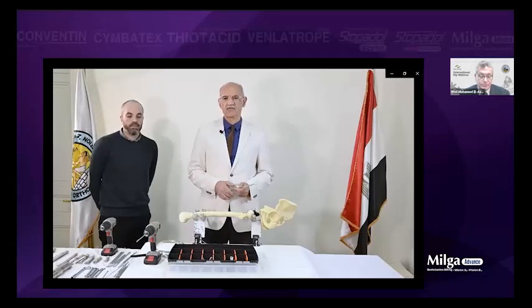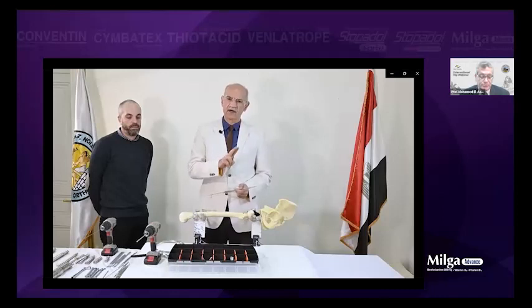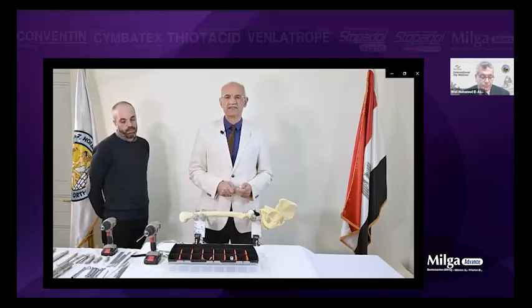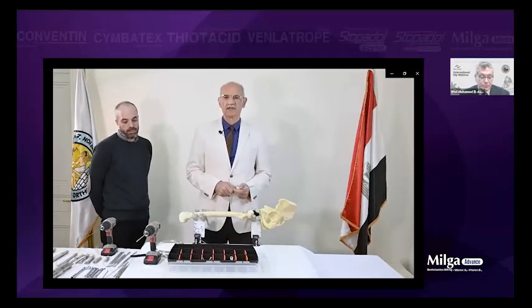I'm going to discuss 5 methods. It's not one method like they taught you, that you have to have 2 half pins above and 2 half pins below in a fixed fixator or something like this. This is not true. This is not practical. I'm going to tell you the tips and tricks of the fixation of the proximal femur using 5 methods.